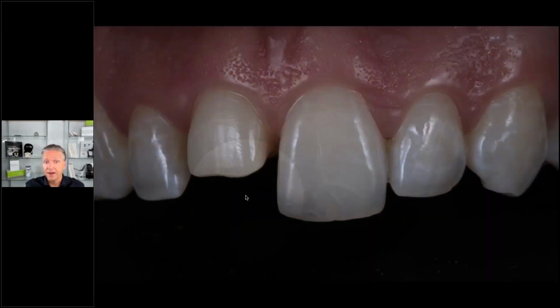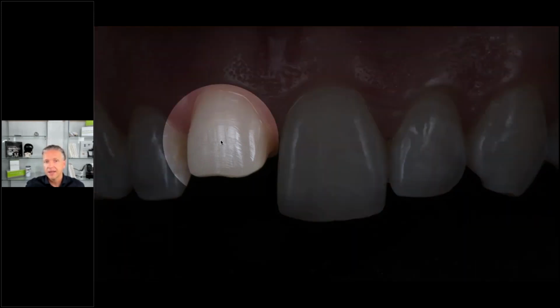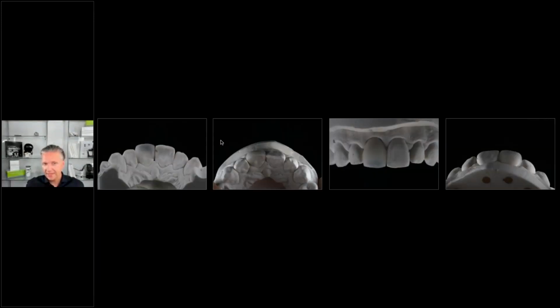There's nothing in there. And what happens if you're doing a veneer now, and I mentioned already, this is all enamel. I like to use an HT enamel ingot, because that will replicate the enamel of that neighbor tooth the best. So I definitely design my veneer in full anatomy here, because I would like to have all my buccal surface in pressed enamel, also for stability, because this will be super thin here. This is maybe 2/10. So I wax it full anatomy.